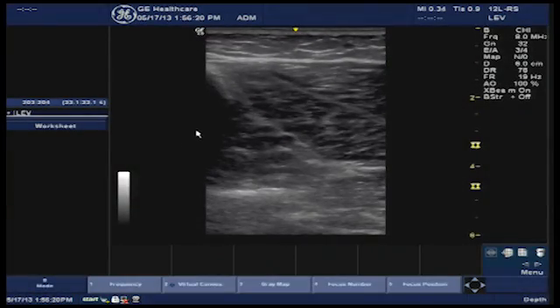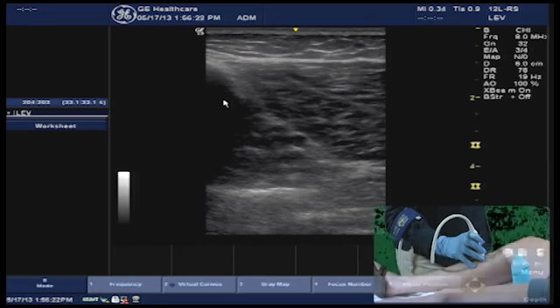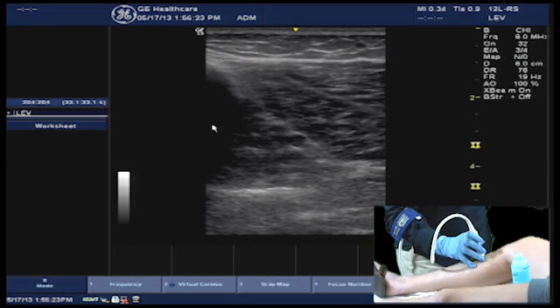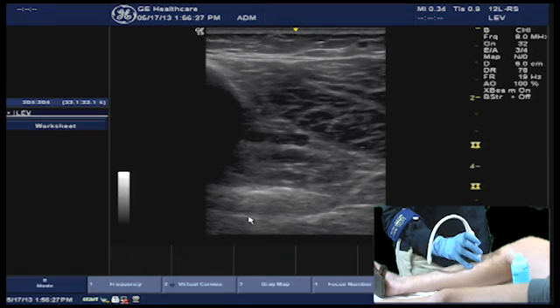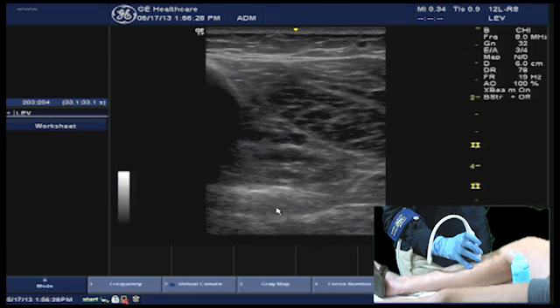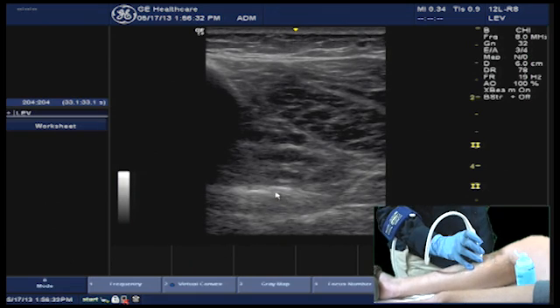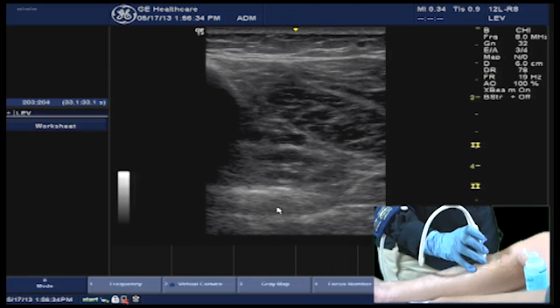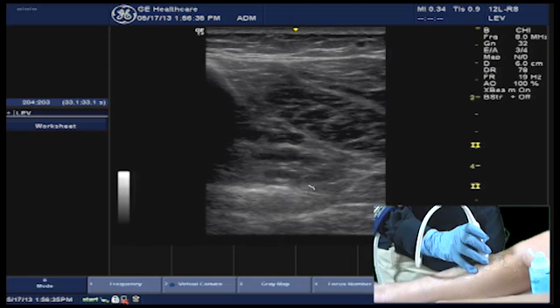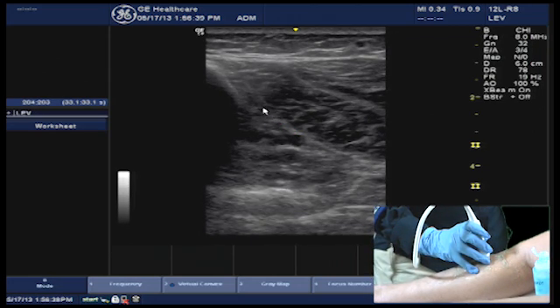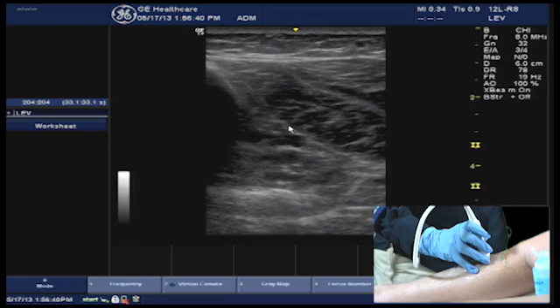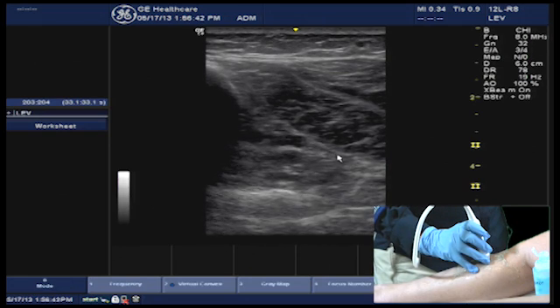These landmarks include the tibia, which we see by the big black shadow here, the fibula at the lateral aspect of the screen with the bright echogenic border and the smaller shadow, and then this bright linear echogenic line that's more diagonal in nature, which is the fascia plane lining the muscle.